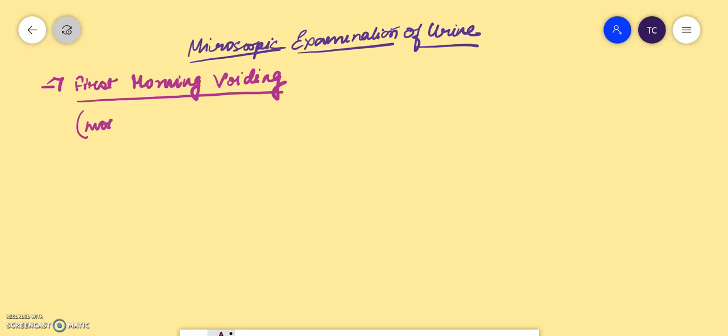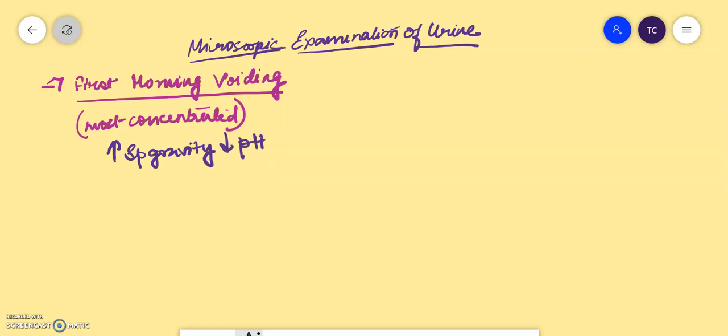Because it is most concentrated at that time. So the morning sample is considered best, as it has higher specific gravity and lower pH. So that is very important.